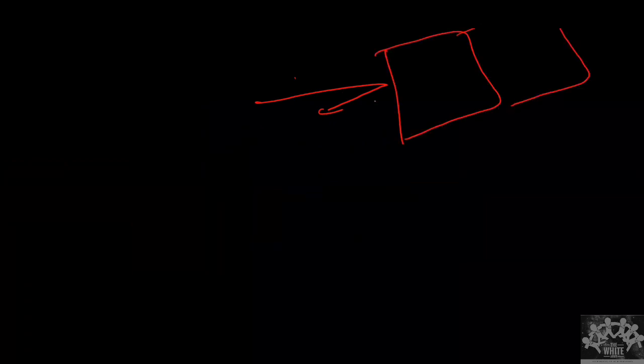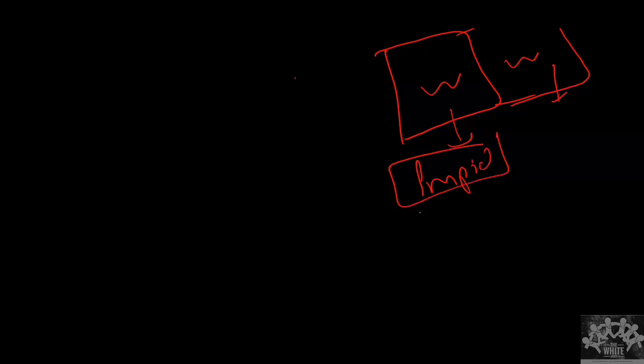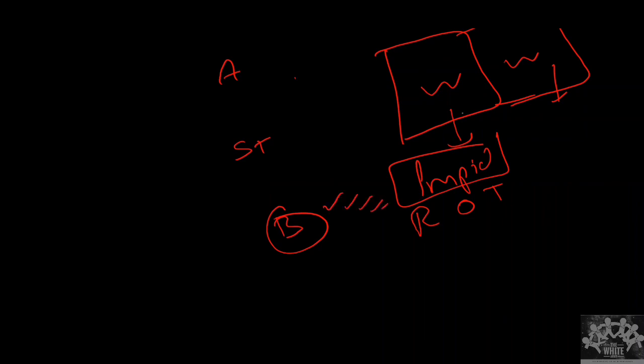See, in ultrasound, the reflection is always dependent on the tissues through which it passes. It doesn't only depend on the density of the tissue or anything. It depends on from what tissue to what tissue it is going. The property of the tissue which decides the reflection is the impedance. Impedance is nothing but the resistance offered by any tissue. If I compare air, soft tissue and bone, the resistance offered by the bone is very high, the impedance of the air is very low, and the soft tissue is in between. The difference between the impedance of the soft tissue and bone is very high.